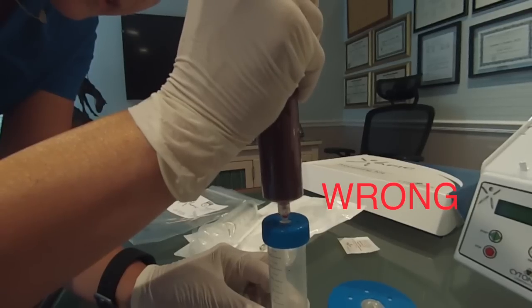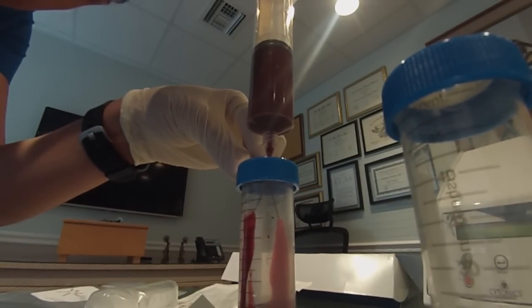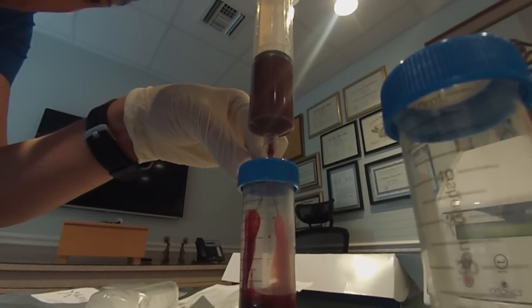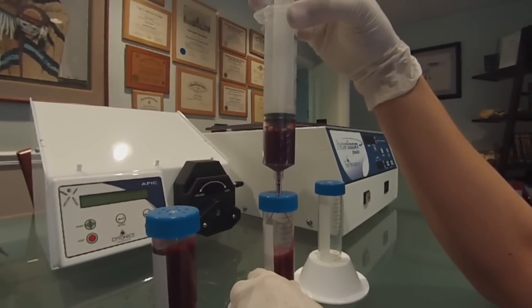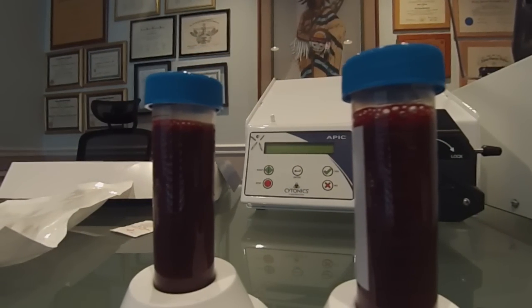Be sure not to force the cannula completely into the APIC centrifuge tube. Transfer the blood from the syringe into the centrifuge tube by pressing firmly enough to have the blood flow down the sides of the tube in a V fashion. Repeat this step for the remaining tubes, ensuring that each APIC centrifuge tube contains the same volume of blood.